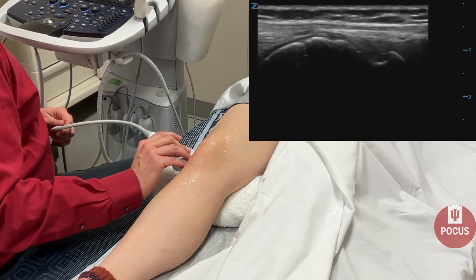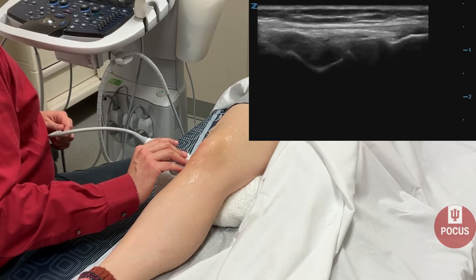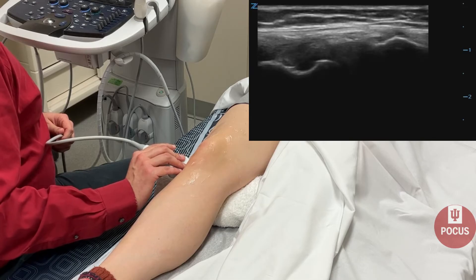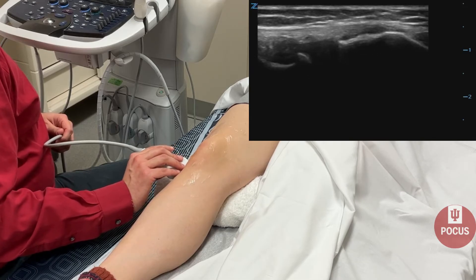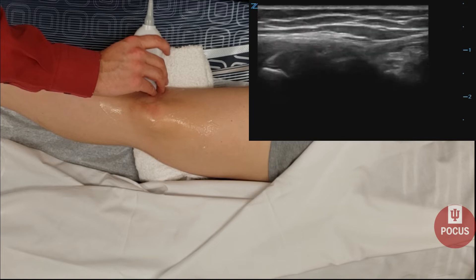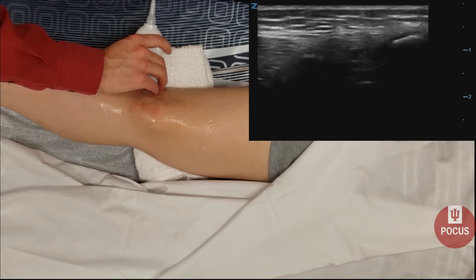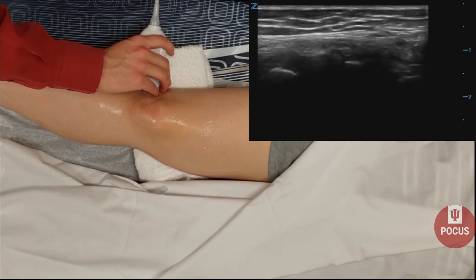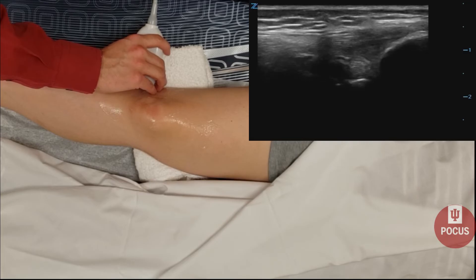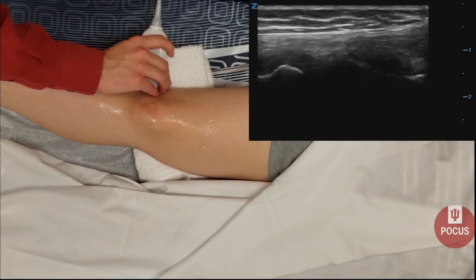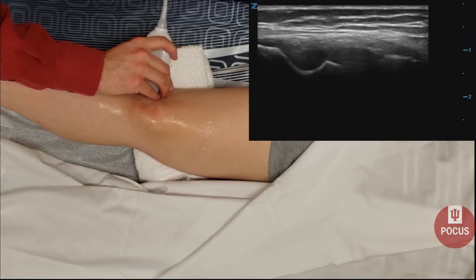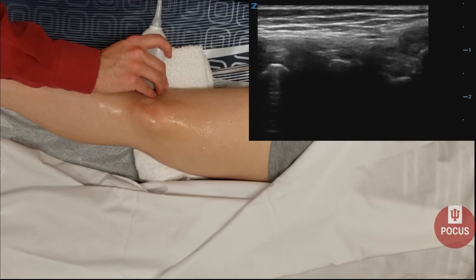Next, we'll look at the lateral joint line, again starting at the femoral condyle and following it down. This little ski slope is where the popliteus hangs out, and then there's the meniscus. If you want to find the lateral collateral ligament, it's a little bit challenging. We like to drop the probe down to the fibula and then rotate ever so slightly to get that lateral collateral ligament in view. It's a little bit of a complex on the fibula because the IT band can also come along the lateral edge of the knee, and also the hamstring tendon.